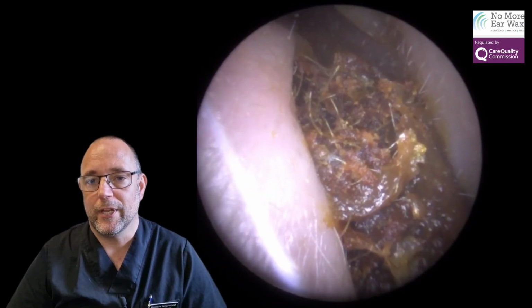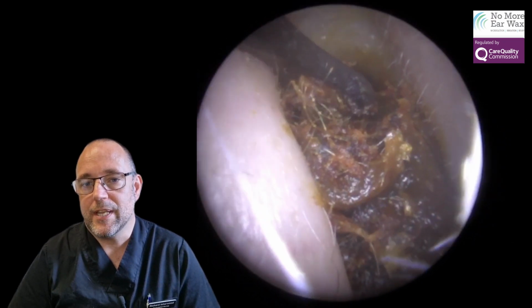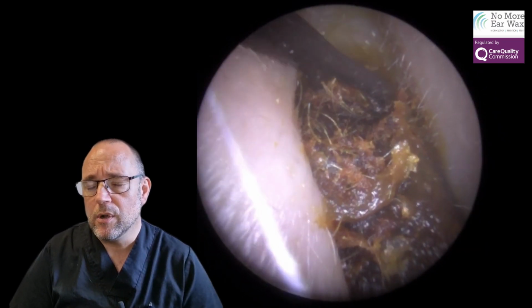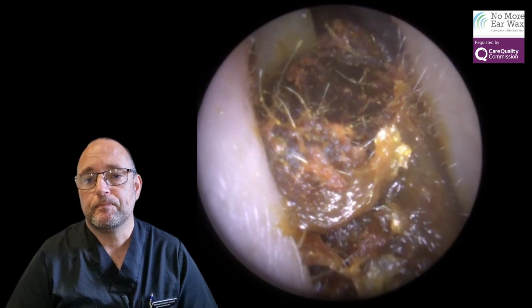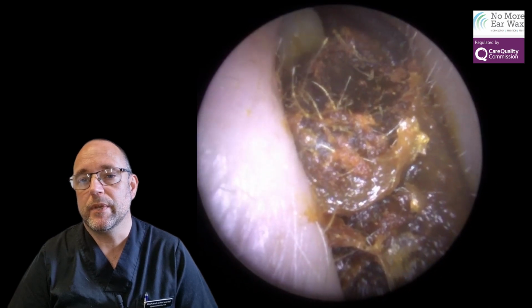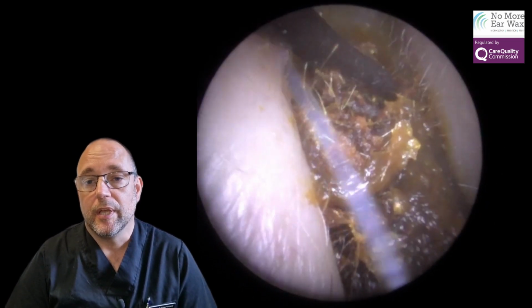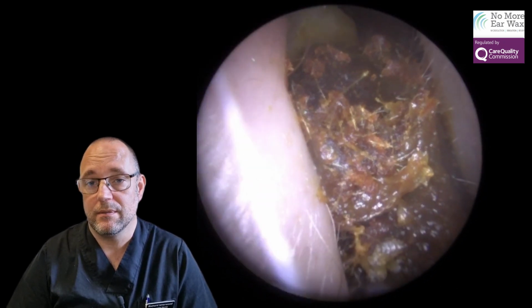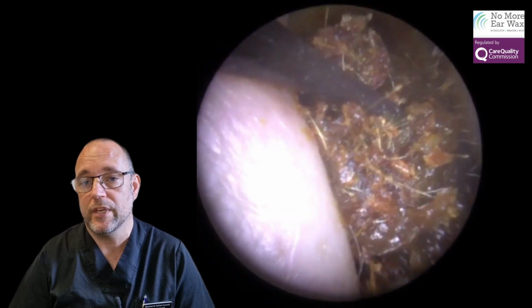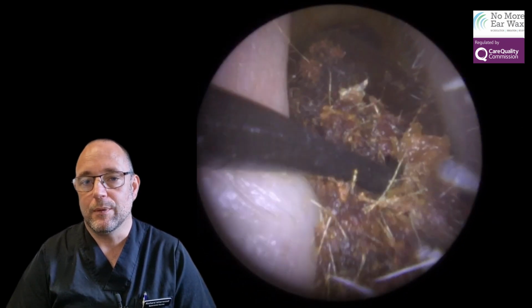I'm not expecting this to get the whole thing out, but even if it just breaks it apart a little and rolls it forward a little bit, it's still going to make it easier. Because you won't see many tools on my video. I do use them quite often, but suction usually works on everything. To be honest with you, with a bit of patience and a good amount of olive oil sometimes. But I just really don't think it was going to work on this.